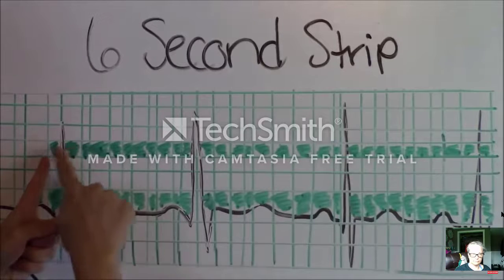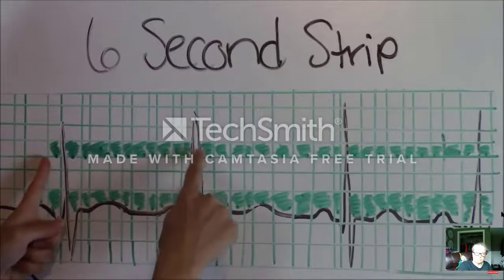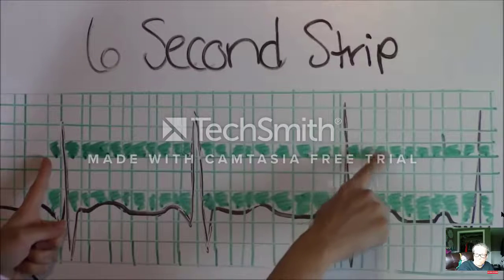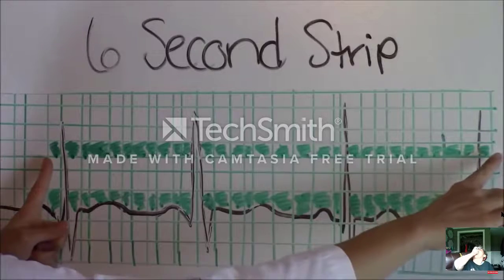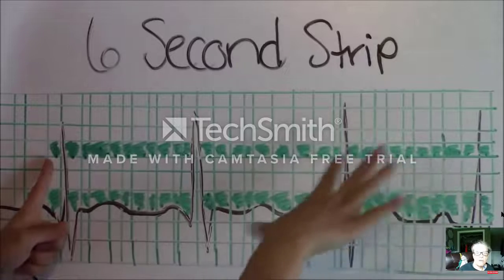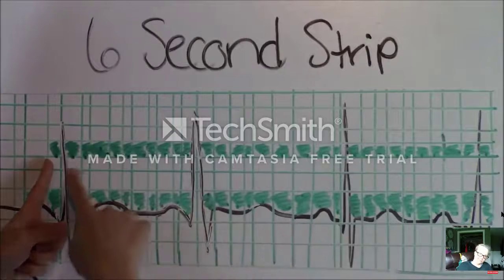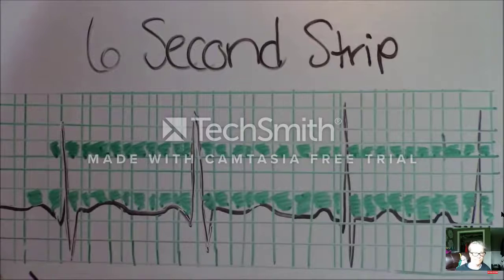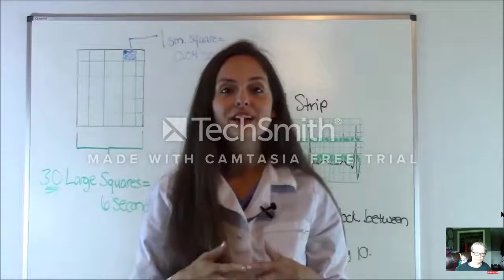So here we go. 1, 2, 3, 4, 5, 6, 7, 8, 9, 10, 11, 12, 13, 14, 15, 16, 17, 18, 19, 20, 21, 22, 23, 24, 25, 26, 27, 28, 29, 30. Let's count how many R waves presented. There was 1, 2, 3, 4. 4 R waves, and you take that number and multiply it by 10. 4 times 10 is 40. So we have a ventricular rate of 40. That is how you use the 6-second rule. Very simple. All you have to do is count and look for your large blocks. That is how you calculate a heart rate using the 6-second rule.